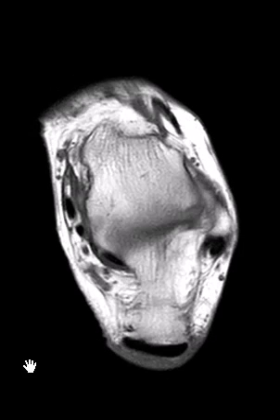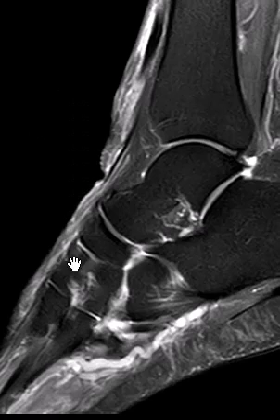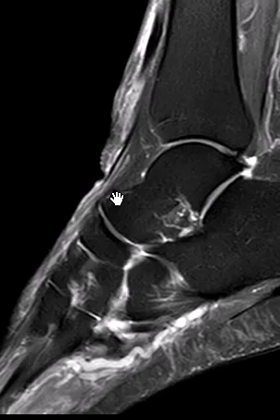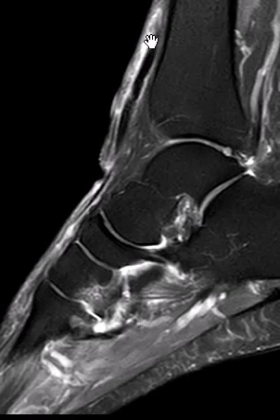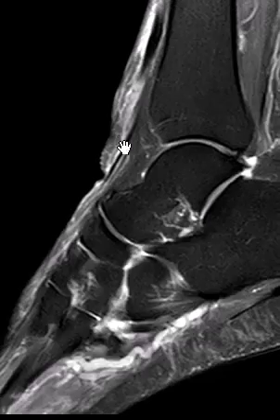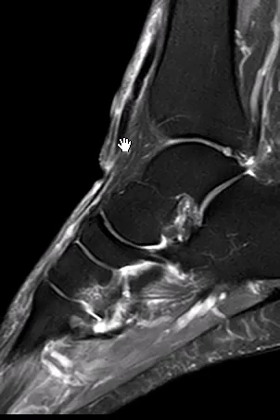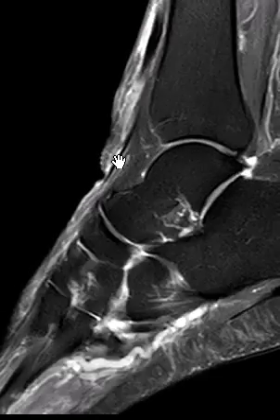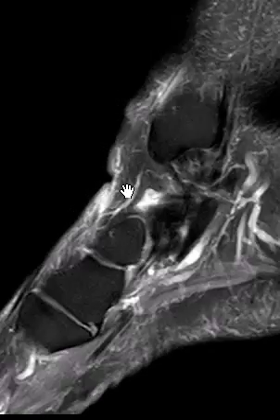Now we're going to go to a sagittal view to confirm. Here's the extensor hallucis coming down — this thin one. You can see it coming across; it looks intact. If we go a little bit more medial, here we see the anterior tibial. It's lax, and the end is right here. It ends just over the anterior talus. So it's completely torn, ruptured, and retracted back to the talus.